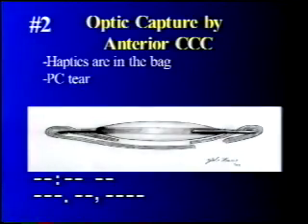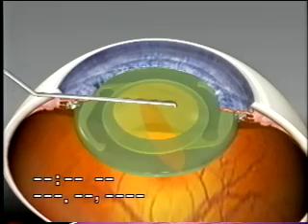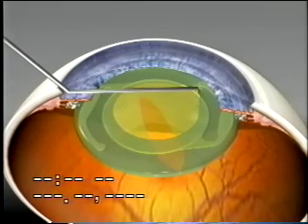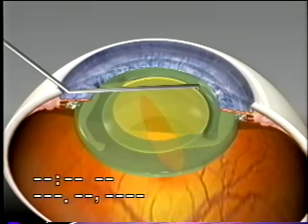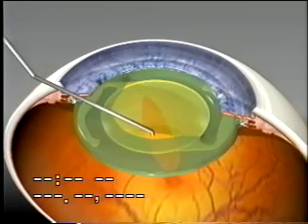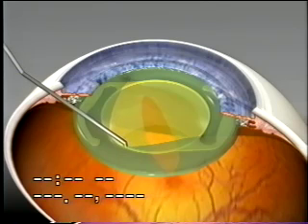The second option: the optic is again captured by the anterior CCC, but this time the haptics are in the bag and the optic is pulled out of the bag. In this animation you see the haptics and the optic in the bag, but a large posterior capsule tear makes bag fixation uncertain. One can merely pull the optic out of the bag to be captured by the CCC to obtain certain fixation of the intraocular lens.